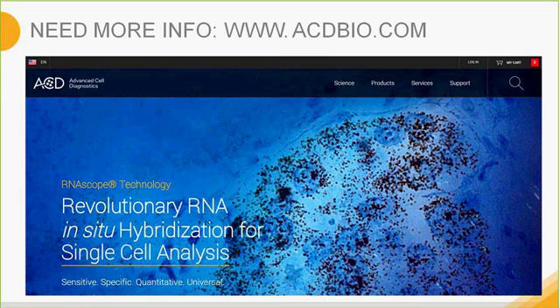Another question is protease plus, can it be used instead of pretreat 3 or 4? We recommend that you go to acdbio.com to consult the pretreatment matrix. Depending on your various tissues, this will require different proteases.